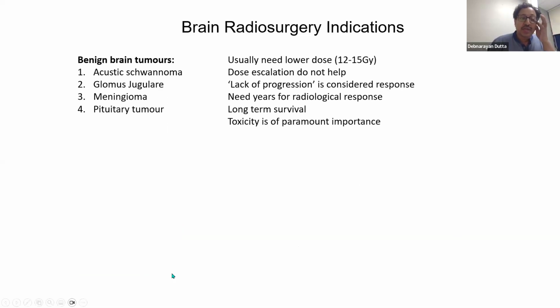Now, when you talk about radiation therapy, there are two aspects. Normal radiation, which Dr. Shruti has already talked about, and something called high precision radiation, called radiosurgery. As Dr. Shruti has already spoken about normal kinds of radiation, like tomotherapy and linear accelerators, let's focus on indications which are radiosurgery, because that is also something new. And I think many of the students here have no clue about radiosurgery and should know, because you people are actually going to use it more often than us.